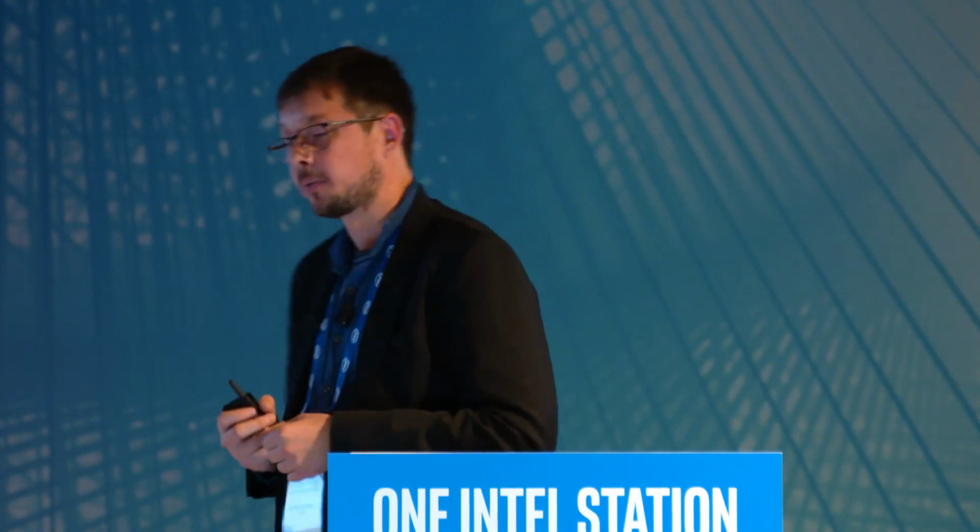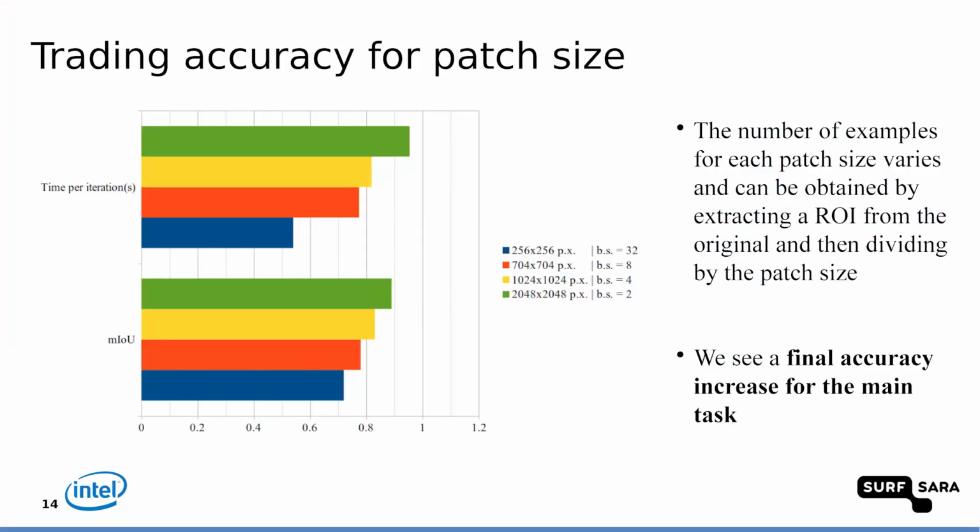But what is interesting is, why did we do this large patch thing? Because in the end, we wanted to reach better accuracy. And in this slide, I show basically the accuracy that is obtained depending on the patch size. So going from 256 by 256, regular size patches that anybody can train on, up to 2000 by 2000 at this moment. And you can see that the improvements are quite significant.